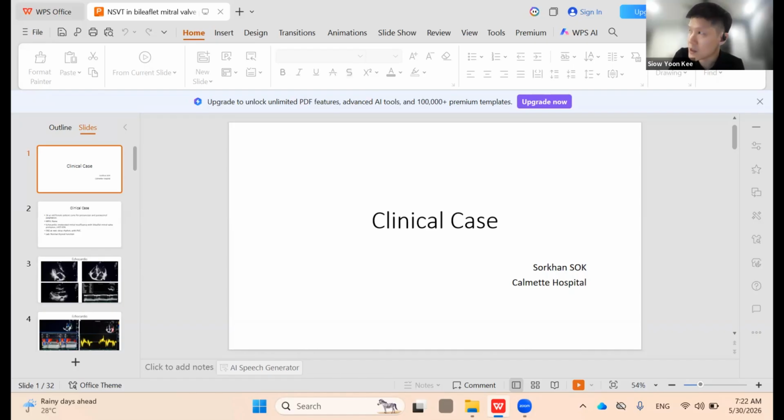All right. So you think the bilateral mitral leaflet prolapse is perhaps because of rheumatic fever, I mean rheumatic heart disease? I think the PVC is from the papillary muscle. The heart ultrasound shows us it is really prolapse with the annular disjunction, 10 millimeters, so it's too long. I'm just wondering whether there is any connection between the PVC and the mitral valve prolapse.